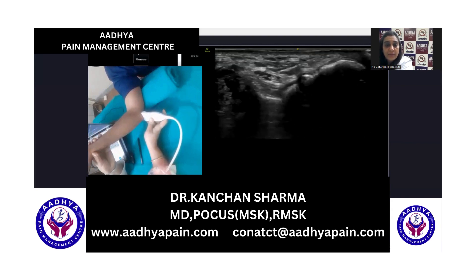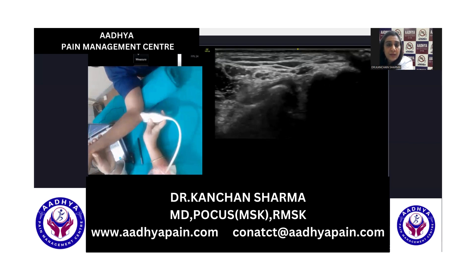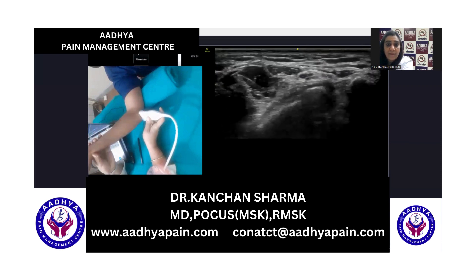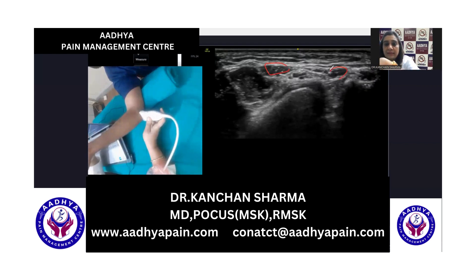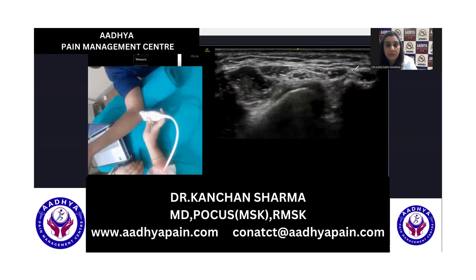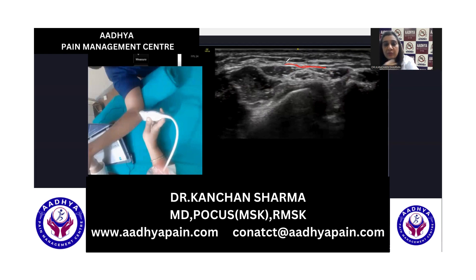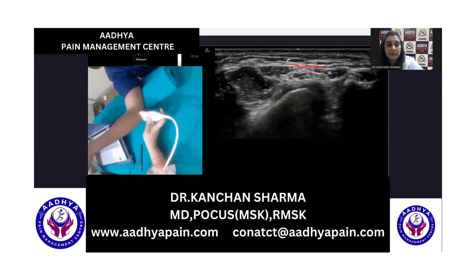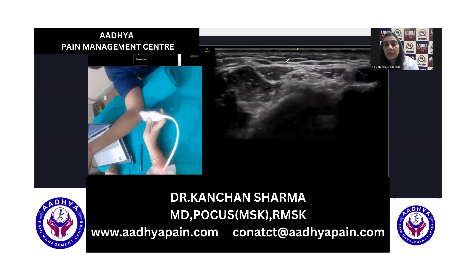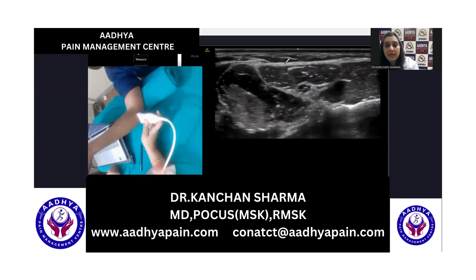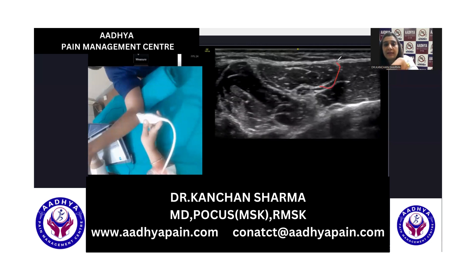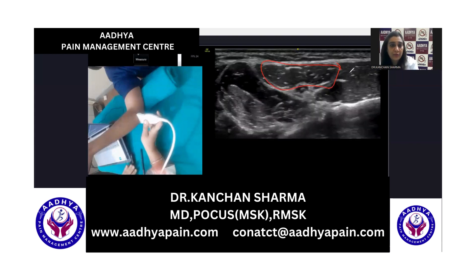Moving down, you will be able to see the two heads of the FCU starting to appear. One is the humeral head and the other is the ulnar head. You will see these two combining. There is a fibrillar structure just connecting these two — we call it the arcuate ligament, or some say it is simply an extension of the cubital retinaculum. Going further down, you will see these two heads fuse, and that is the FCU in short axis.